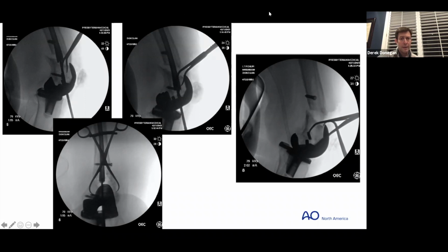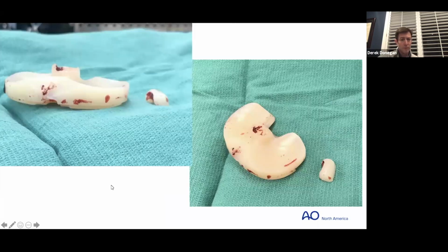One of the things that you guys had mentioned earlier was talking about the knee and what happens to the poly. This is a posterior stabilized knee. When we did the arthrotomy, this is what we found. Who knows when this happened, but this lady had her post broken off. So it's one of those thought processes, if you're going to do this, to have either the stuff around or the ability to change things out if you need to, which we asked for in this case.